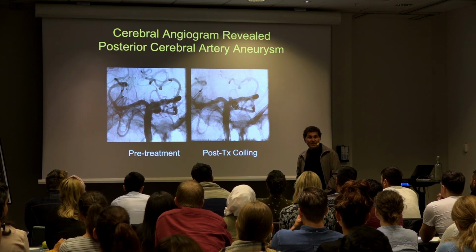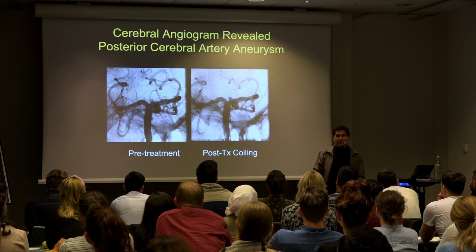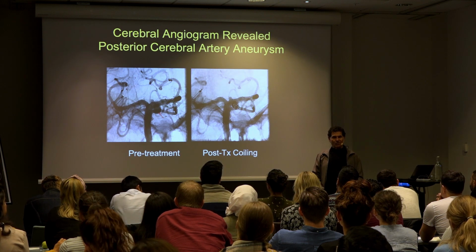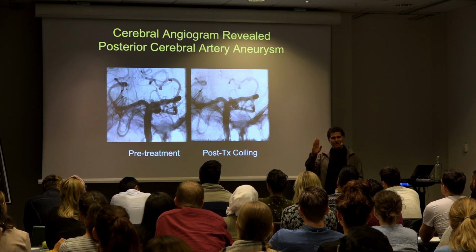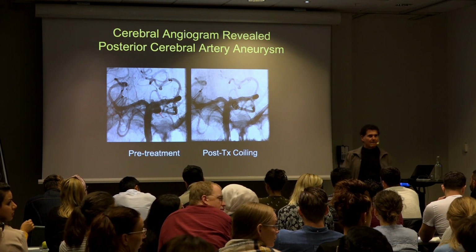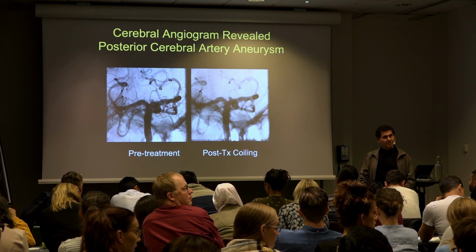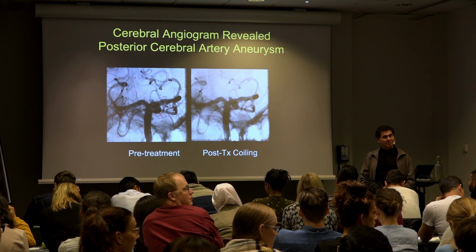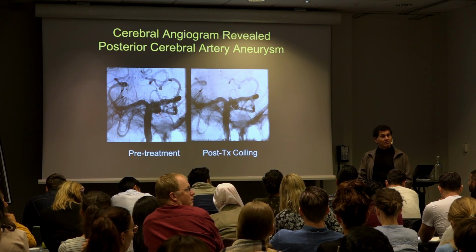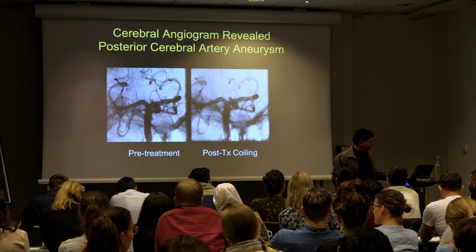So I show this case because as good of a neuro-ophthalmologist as we are, we rely on visual tests, which wasn't that abnormal in this case. And if you go back, there were some points respecting the vertical. I don't understand how there was an effect on the ganglion cell on the OCT map, but not on the visual field. Well, it's not clearly on the visual field that there is a problem.